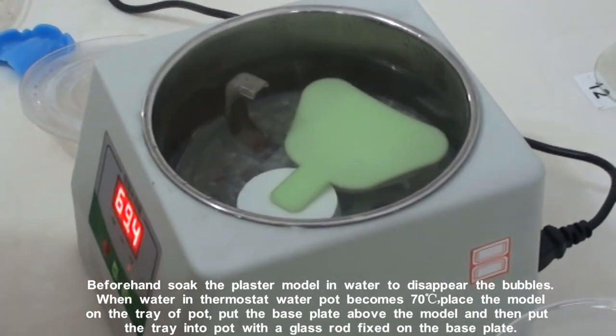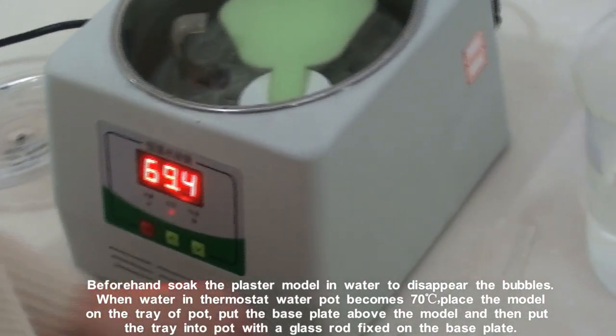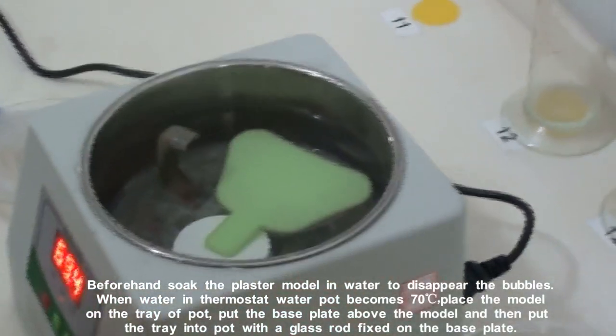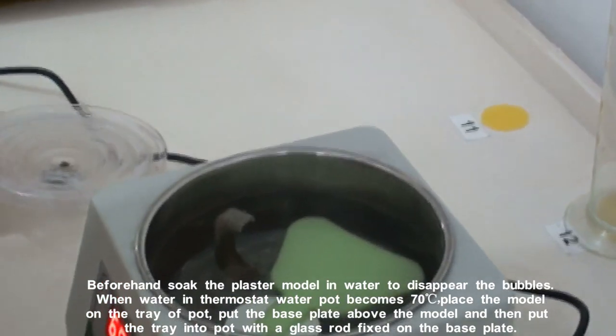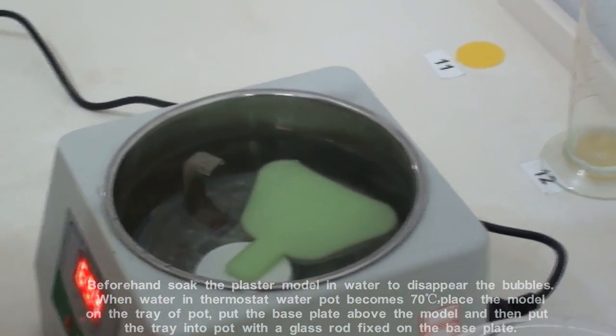When water in the thermostat water pot becomes 70 degrees centigrade, place the model on the tray of the pot, put the base plate above the model, and then put the tray into the pot with the glass rod fixed on the base plate.